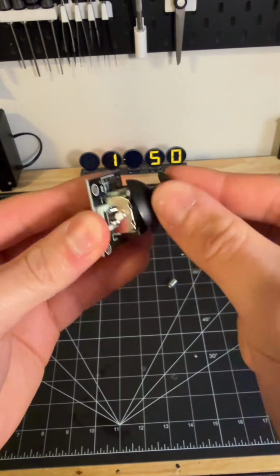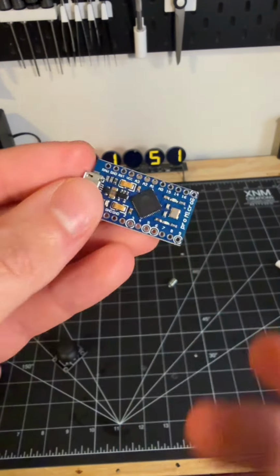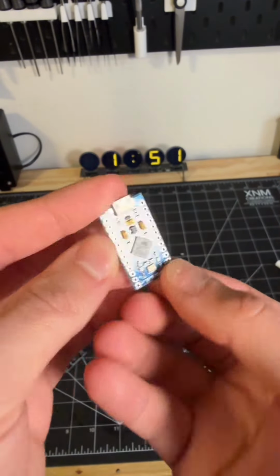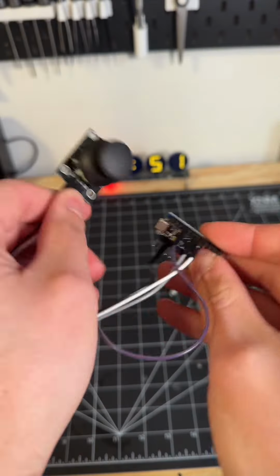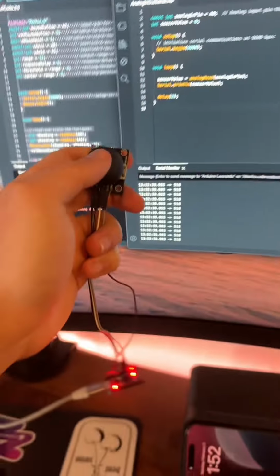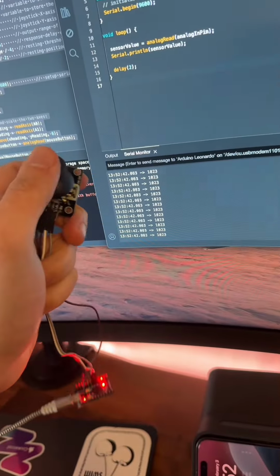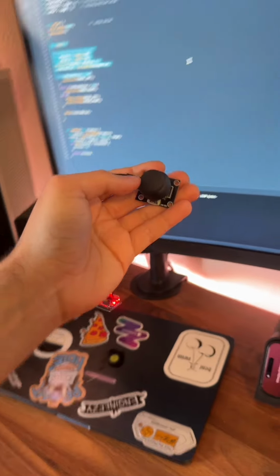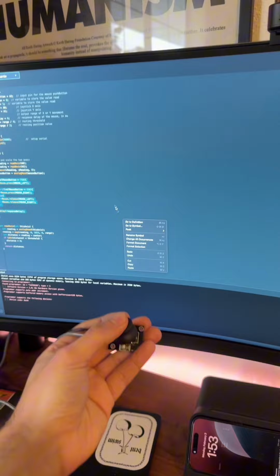So this is a little joystick component I had laying around, and this is called an Arduino. It's a programmable mini computer that I could plug things into these pins and program it to do pretty much whatever I want. Hook them up together and we'll see if we can read the data off the joystick. Got it plugged into the computer, and I've written some simple code to read the value off the joystick, and you can see here the numbers changing when we move the joystick, so that's working. I'm now gonna see if I can write some code to trick the computer into thinking this little Arduino is a mouse. After a lot of troubleshooting, you can see here that the joystick plugged into the Arduino now acts as the mouse on the computer.